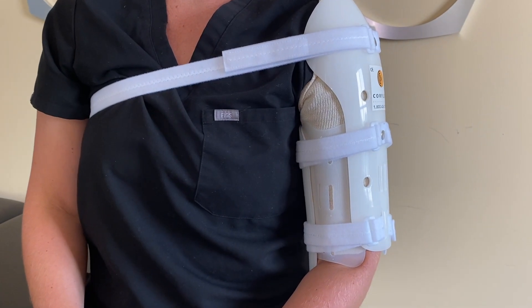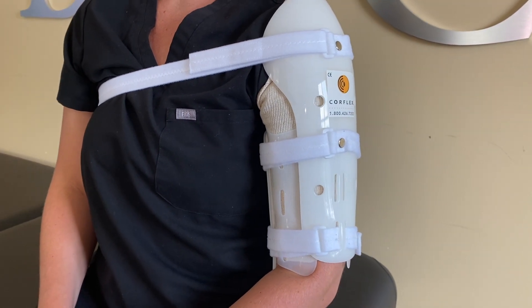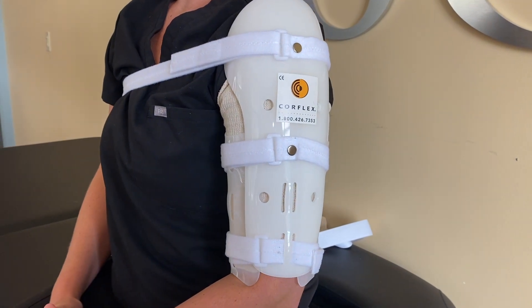This is the Humeral Fracture Splint by Corflex. The splint is commonly used for stabilizing humeral fractures, or a break in your upper arm. Your splint may slightly differ in style as there are many models and brands, but generally they function the same.